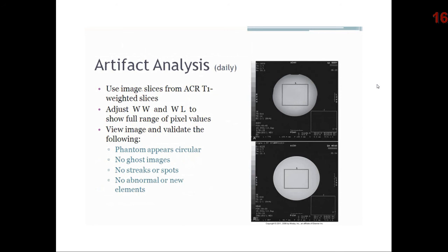that are a result of the failure of one or more MR scanner subsystems, such as the radiofrequency system, gradient system, imaging and data processing, and magnetic field homogeneity. Each day, the MRI technologist should be checking each phantom image and looking for signs of ghosting, geometric distortion, changes in signal intensity, and any other interference with known parameters of the image.